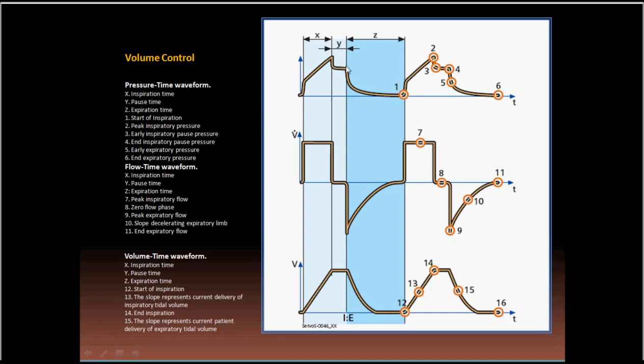And you are measuring now the plateau pressure, which is the pressure inflating the alveoli. This is what we call the plateau pressure. And after that, you open the expiratory limb, so there is a deflation, and it comes back to the starting point, whether PEEP or 0 point, which is the functional residual capacity, or above it in case of PEEP.